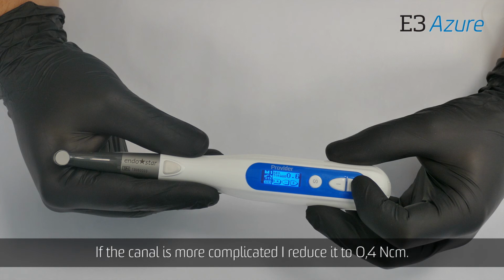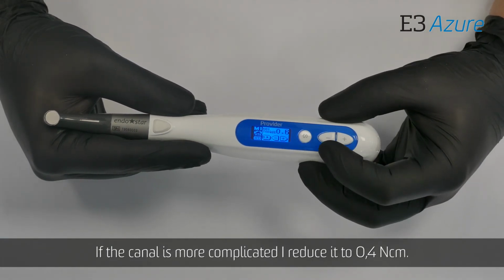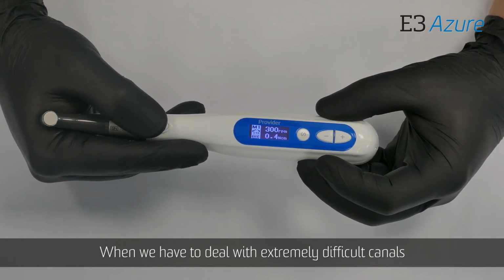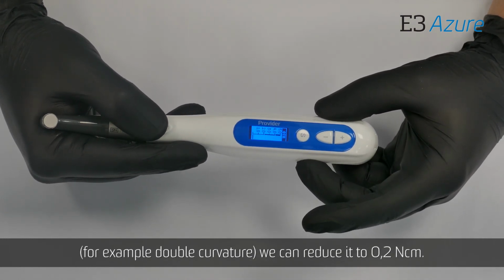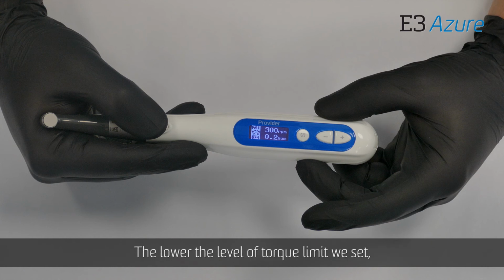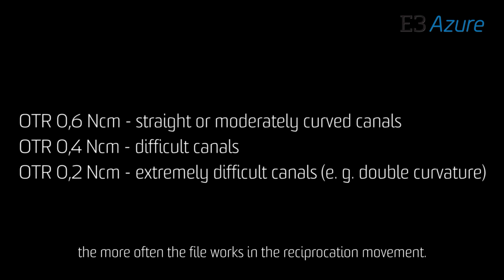If the canal is more complicated, I reduce it to 0.4 Newton centimeter. When we have to deal with extremely difficult canals, for example, double curvatures, we can reduce it to 0.2 Newton centimeter. The lower the level of torque limit we set, the more often the file works in reciprocation movement.